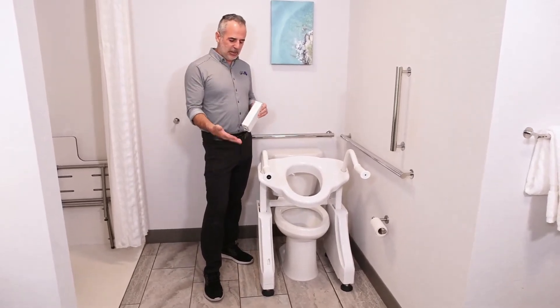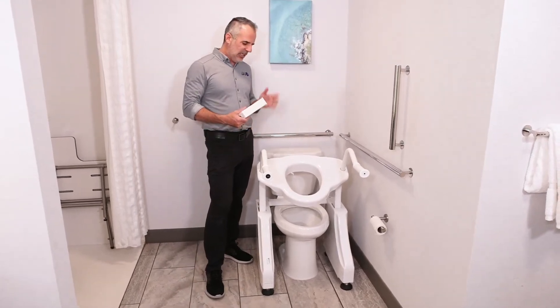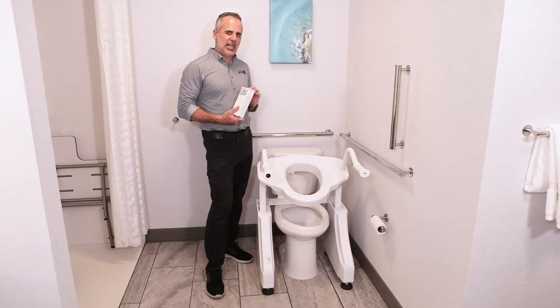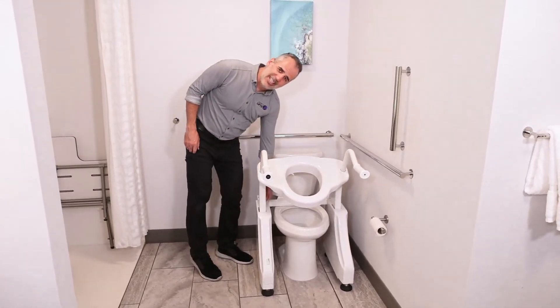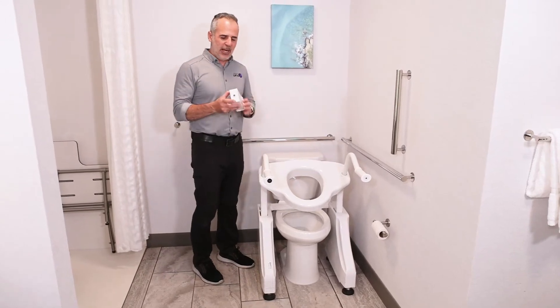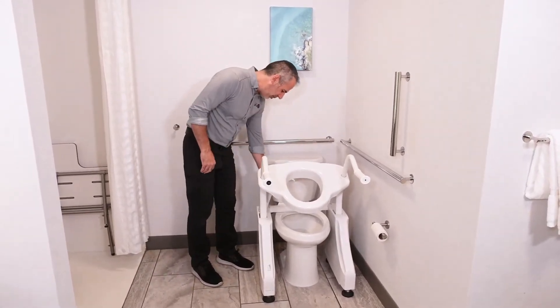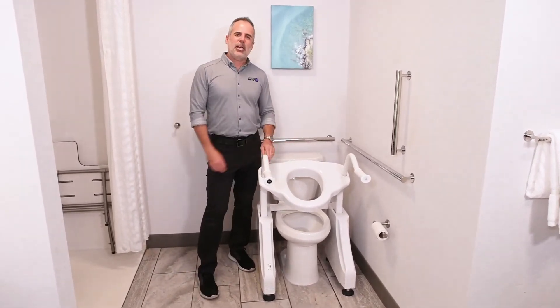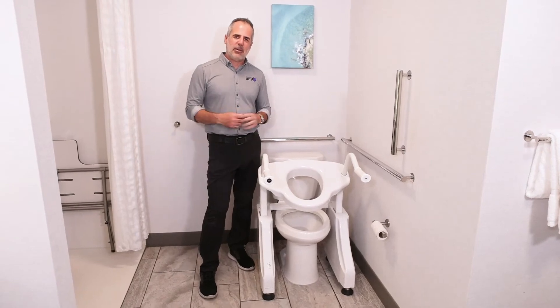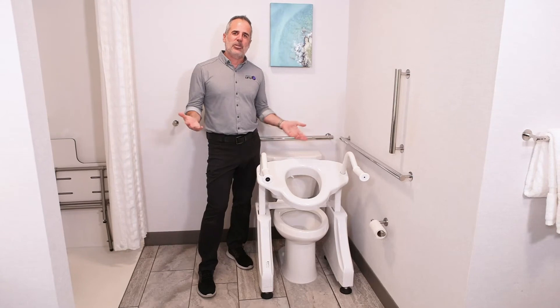Since the lift most of the time doesn't do any electrical work — it's just sitting here waiting to be used — the battery lasts a very long time. This battery will last you one month before you have to charge it. To charge it, you can take your battery out and bring it to the charger, or you can bring the charger to the lift and plug it into the back. If you have an outlet near your toilet lift, leave it plugged in all the time — like you would an iPad or a phone — it will stay charged and will work even when the power goes out.